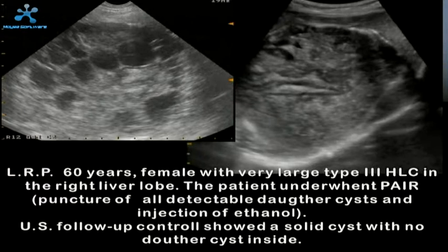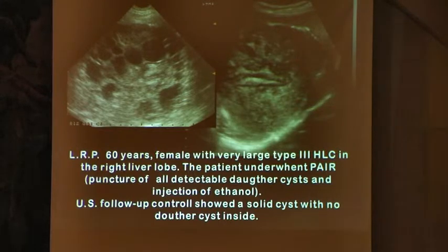Probably this kind of cyst is too difficult to treat by this procedure, and probably other procedures could be useful. Someone is trying microwave or RF, and we are thinking to treat this patient by insertion of microwave to cook also the daughter cysts that we can see at the ultrasound.